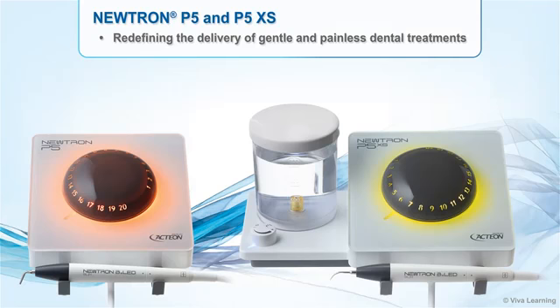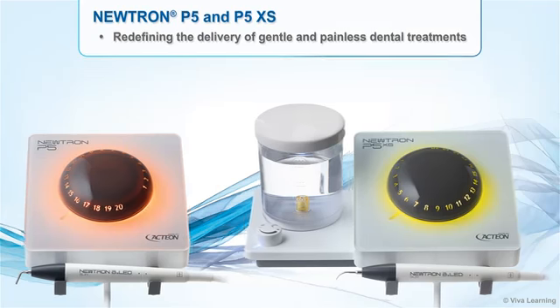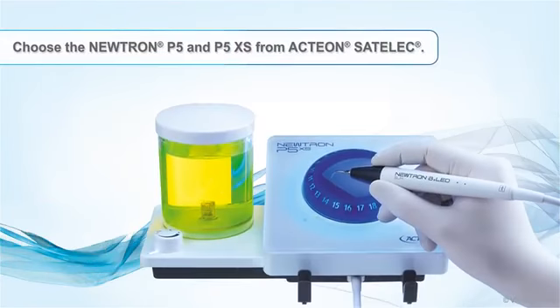Totally redesigned to meet the needs of today's practitioners, the Newtron P5 and P5XS are redefining the delivery of gentle and painless dental treatments. For the ultimate in ultrasonic generators, choose the Newtron P5 and P5XS from Acteon Satelec.